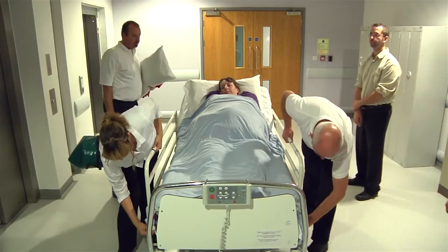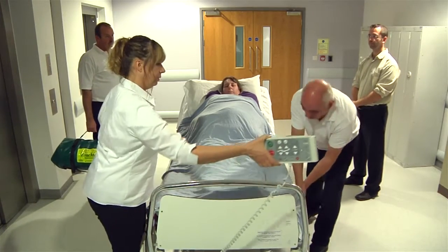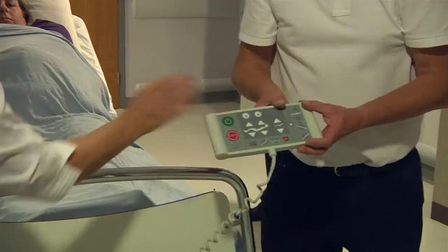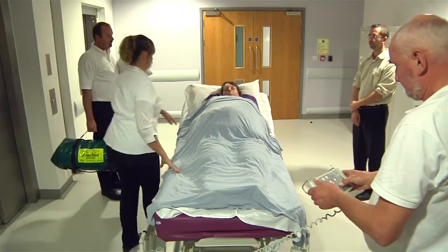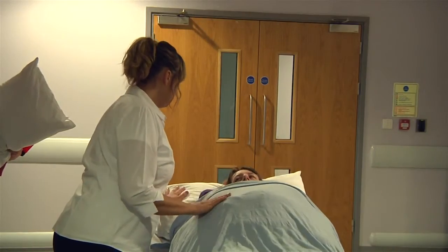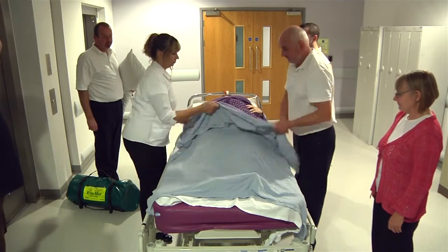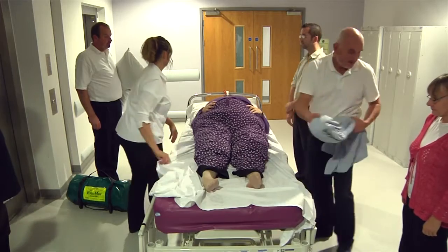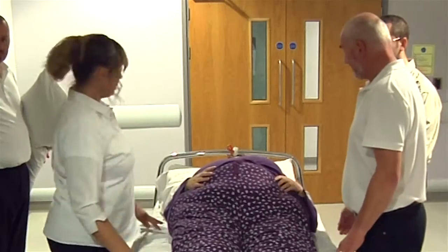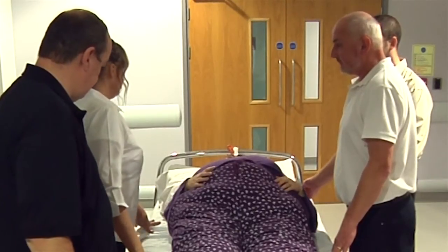If time allows, always work with the bed at a comfortable height. One person should take a lead role to ensure communication throughout the process is clear and effective.